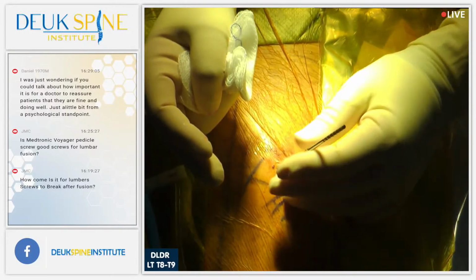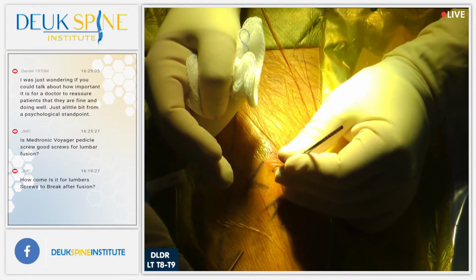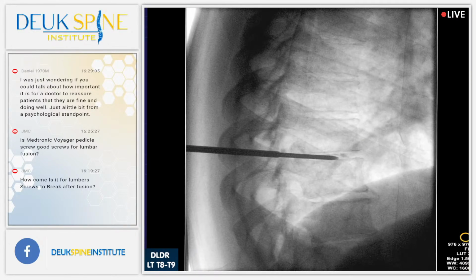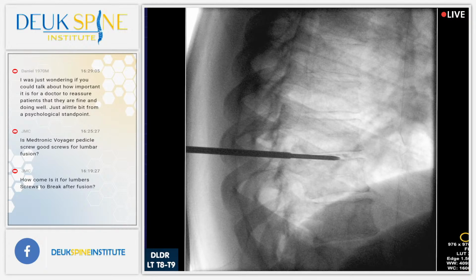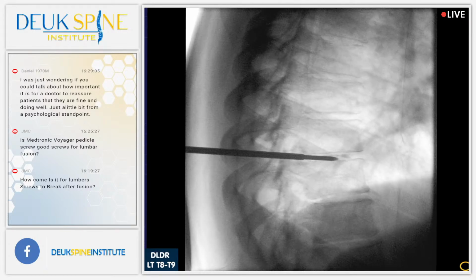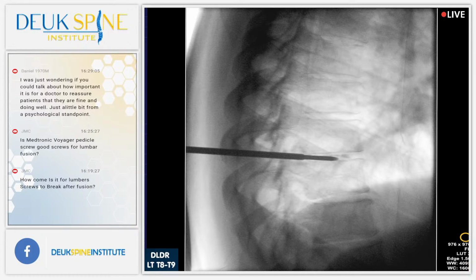And everything's going well. I'm now feeling the back of the disc, or close to it. That's probably the facet. I have to get past it. I feel the herniation. We're inside. We got to go a little further in.